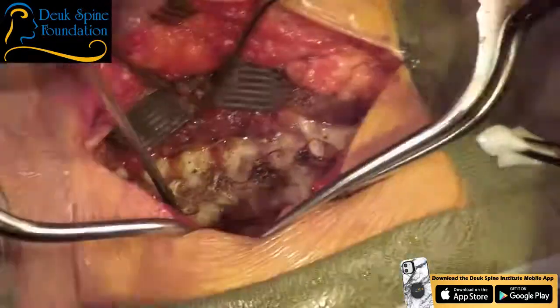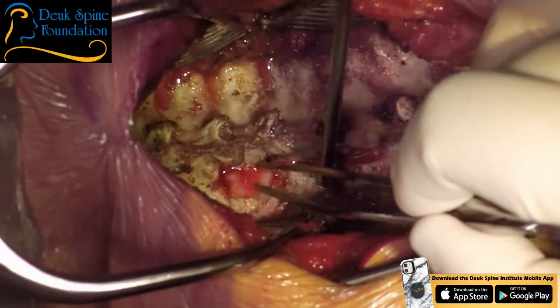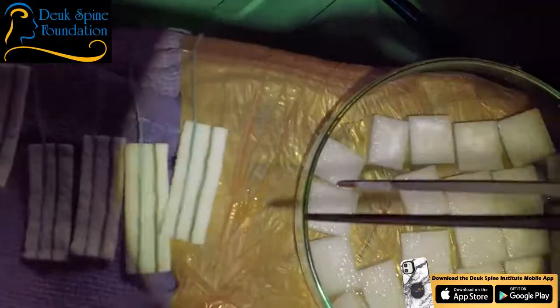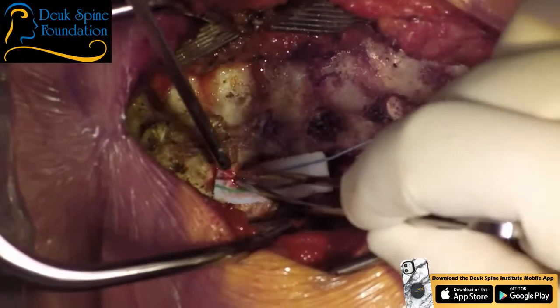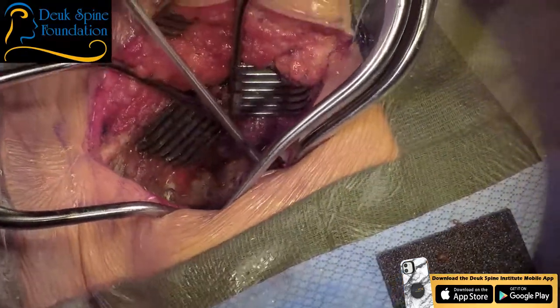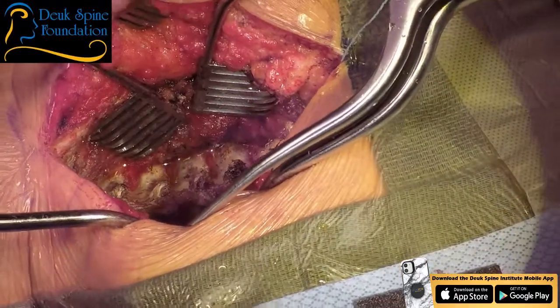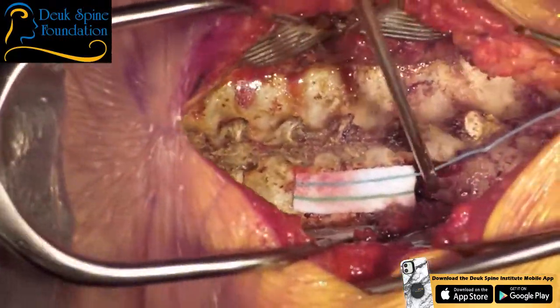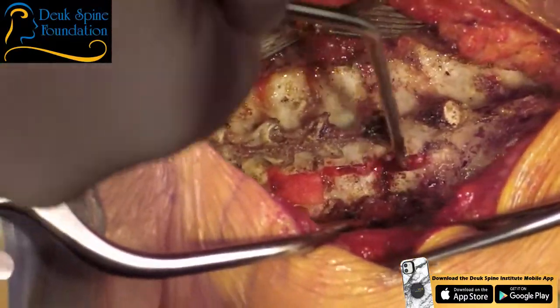But you don't want to use too much bone wax, because bone wax is going to block fusion, and you want these raw surfaces available for fusion. The more raw surface you have available for fusion, the more likely fusion will occur. Fusion is very surface area dependent. All right, we've done our osteotomies then at 7, 6, 5.